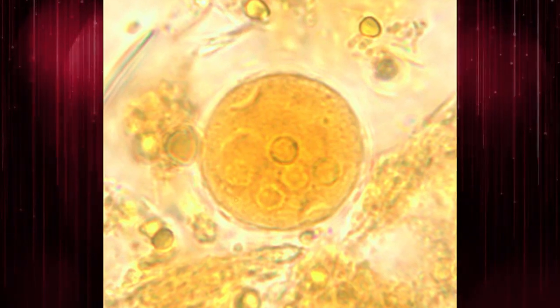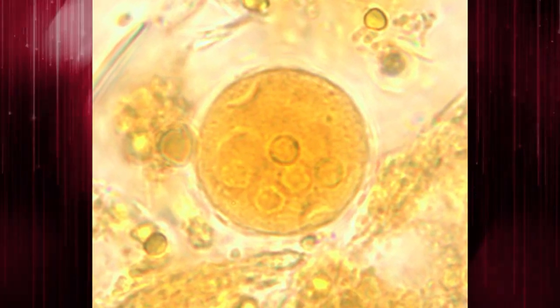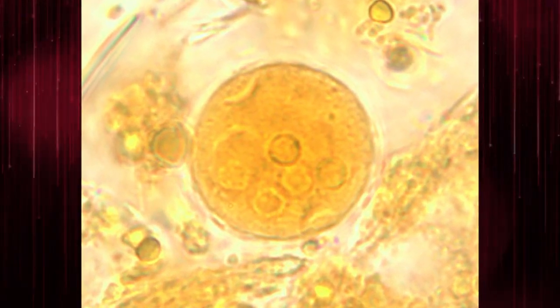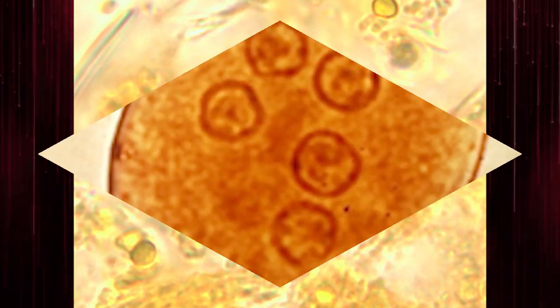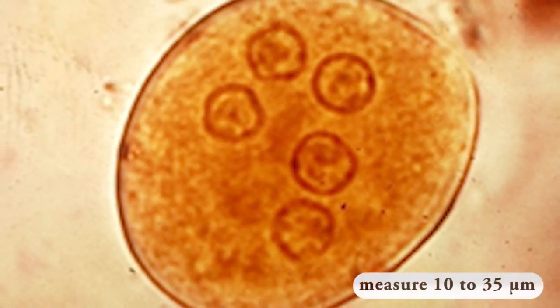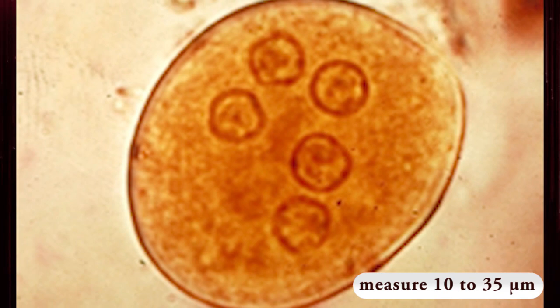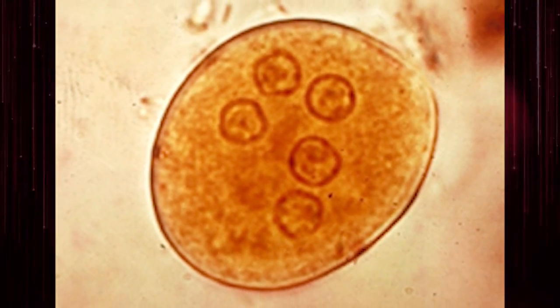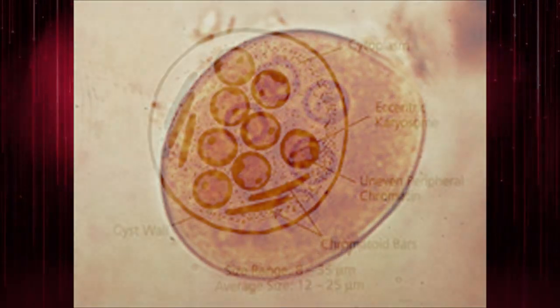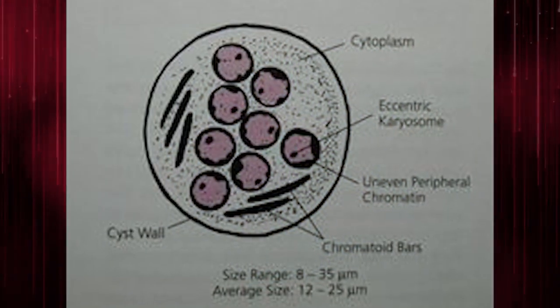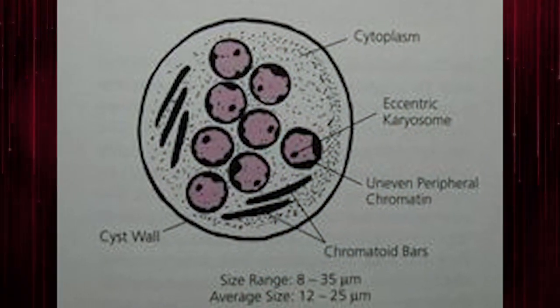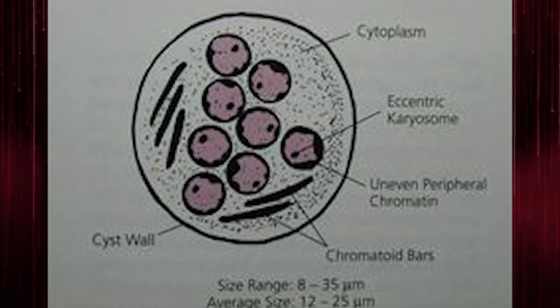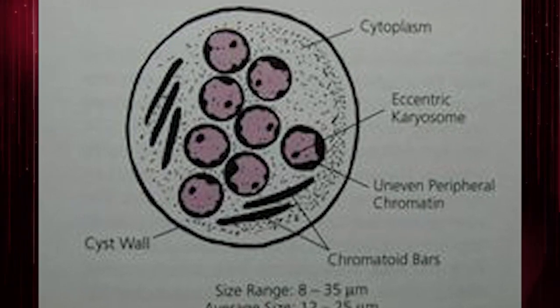Cysts of Entamoeba coli are usually spherical, but may be elongated, and measure 10 to 35 micrometers. This means they are slightly larger than the cyst of Entamoeba histolytica.